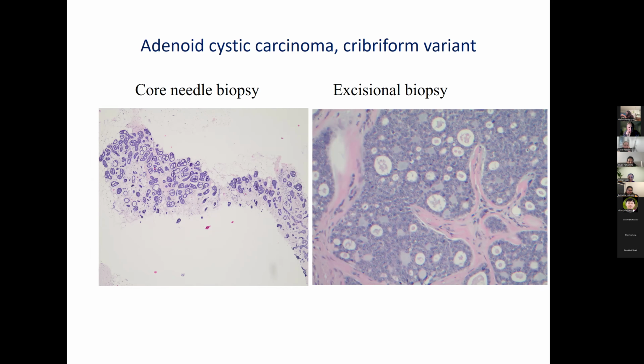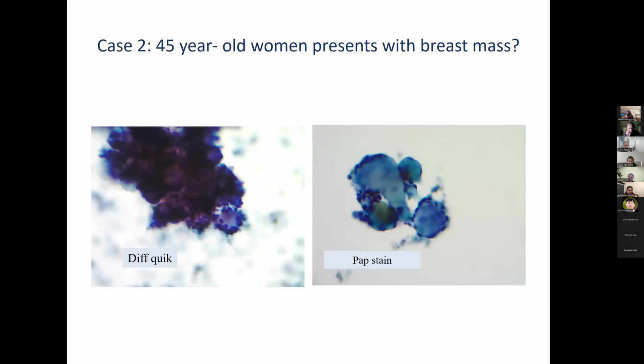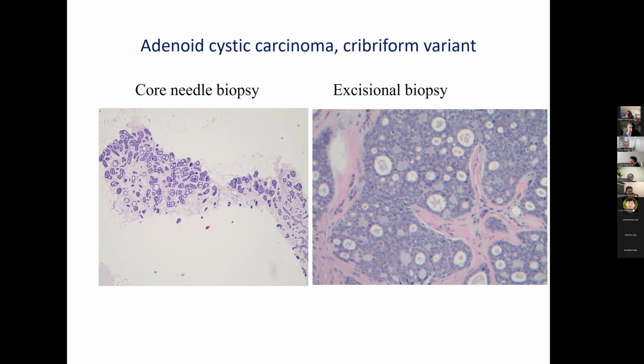The excisional biopsy showed again this collagenous material. So if you go back to that slide, this basement material is what you're seeing here. So that actually catches your eye here. This is the kind of material, and the nuclei are circling around it. So you have the myoepithelial cells around the collagen balls. So once you see this picture in cytology, you will not forget it.